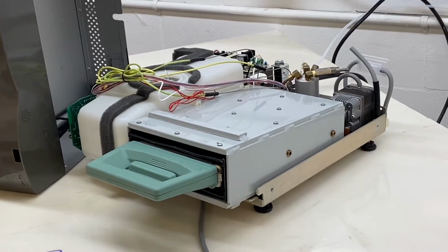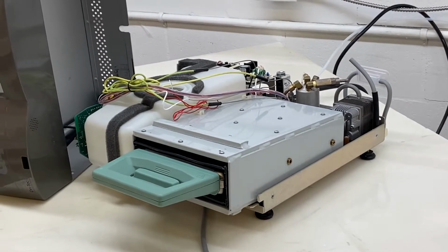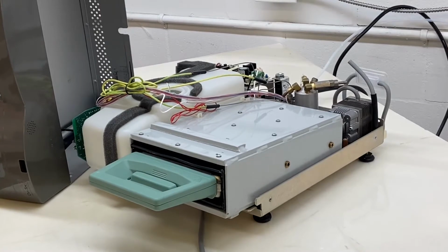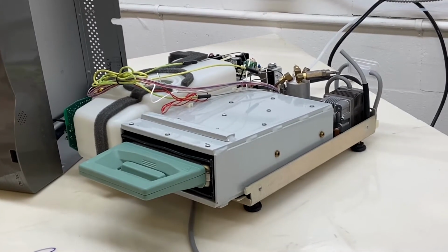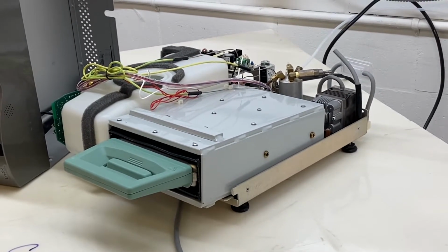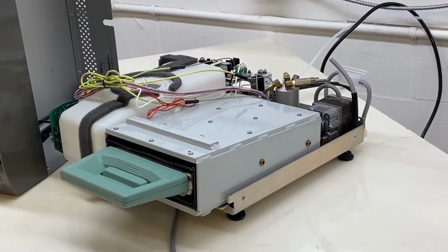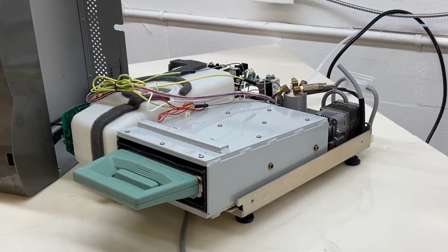We're talking G4 error codes. We're talking G4 error code 6, cycle fault number 6. Cycle fault number 6 is the software has detected the validation thermocouple temperature to be 5 degrees greater than the chamber during the sterilization phase of the cycle. So this is going to be during the sterilization phase of the cycle.